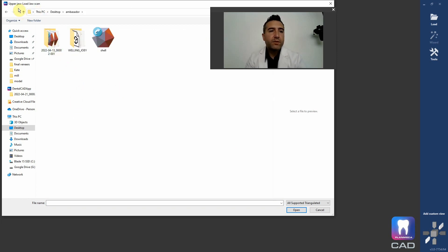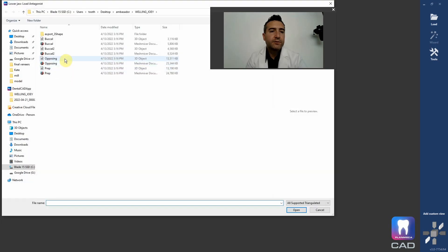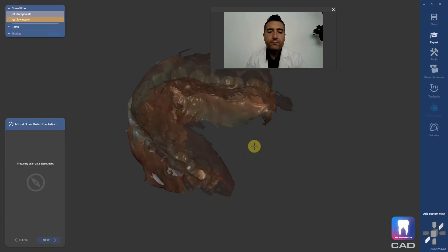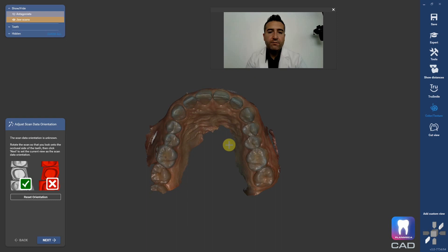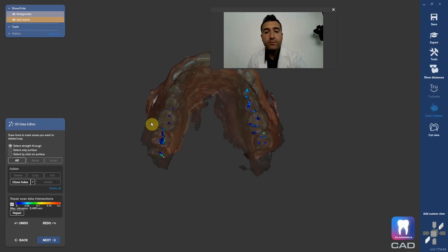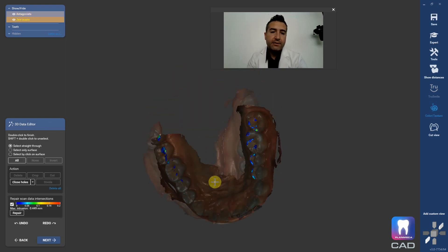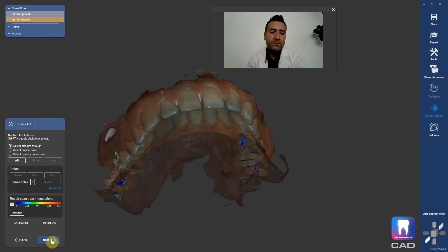It's asking me for the upper jaw scan and opposing — that's all you need. The first thing you're going to do is set your model orientation. You want to be coming down from kind of this incisal view. This is just in the wizard — it just asks you what to do. Now it's saying if you pick digital impression, it's going to prompt you to trim up some floaters and things like that. You could come in here and circle and delete things, but for the purposes of this tutorial, let's just hit next.